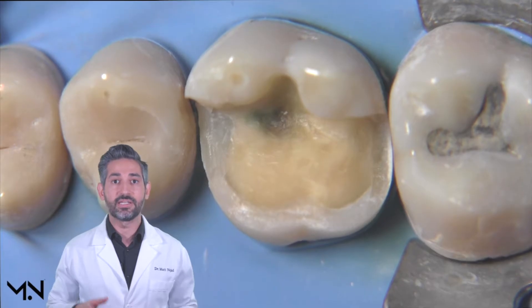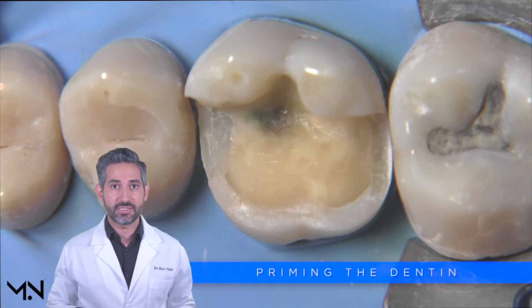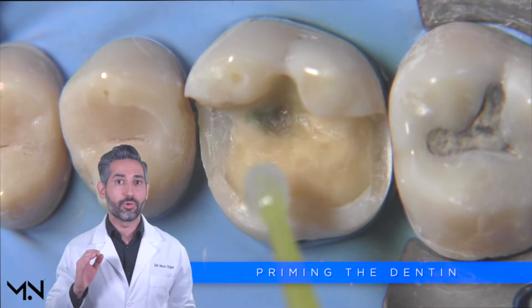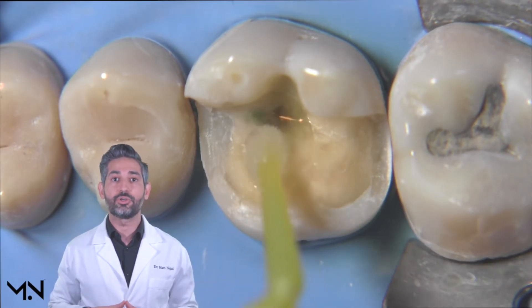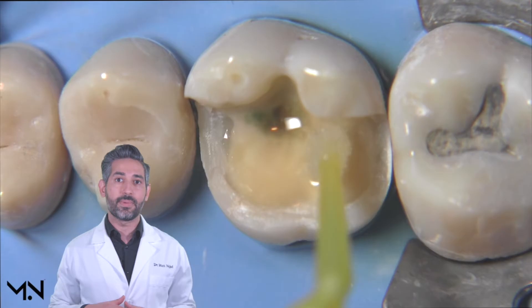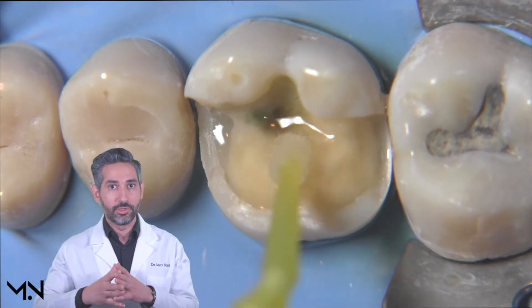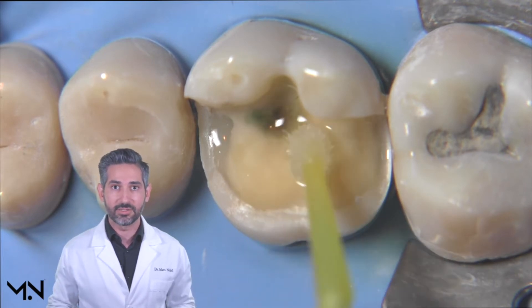The first step of immediate dentin sealing is priming. During this step, the goal is to prime the entire dentin surface, and in order to do that well, you need to make sure you don't miss any areas. I recommend priming slightly past the dentin — going a little bit past the DEJ — to make sure you don't miss any areas.